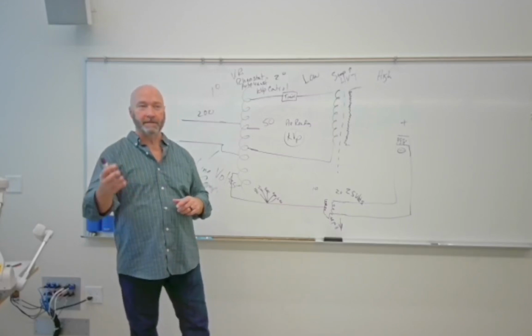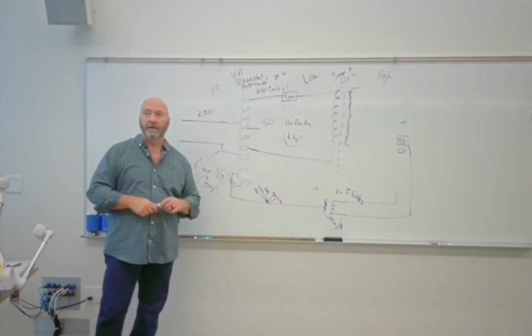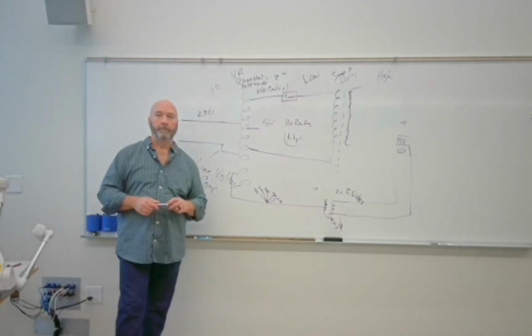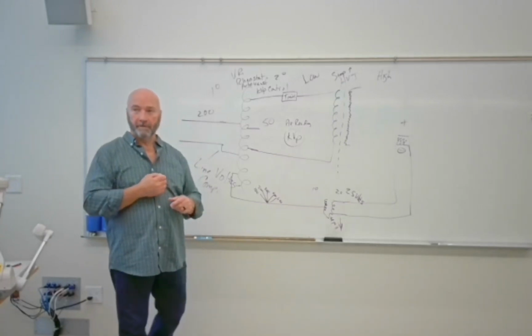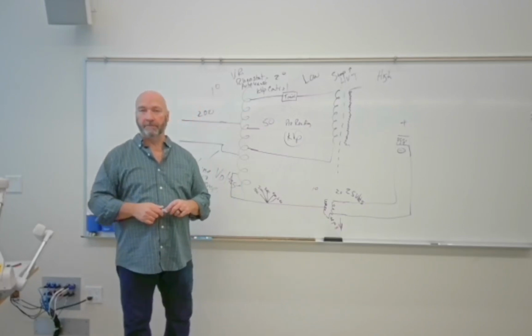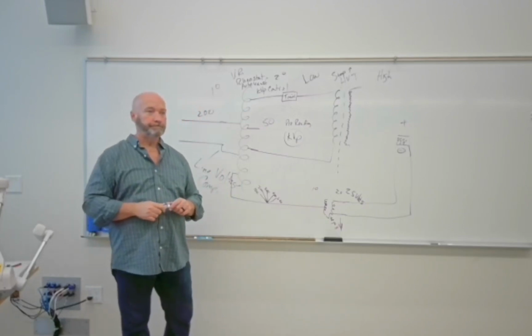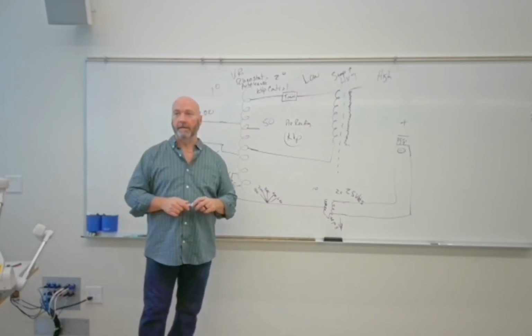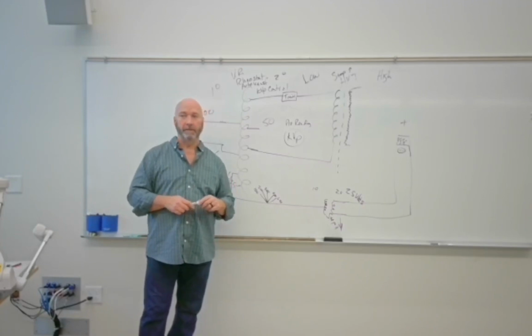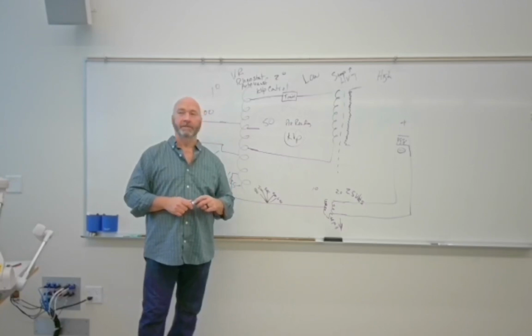The reason I say cardiac catheterization is because what are they looking for in the cardiac cath lab? Looking for vessels in the heart. What type of motion do you have? You have two types of motion: voluntary and involuntary. So you tell the patient, stop your heart. What's going to happen? The heart is not going to stop. You can tell them to hold their breath, but you can't tell them to stop their heart.